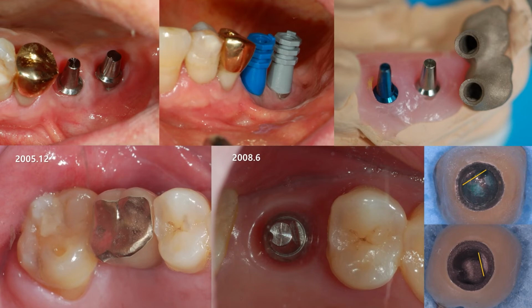Next is a case using a solid abutment. It's a very good method, but this kind of problem can occur. Screw loosening occurred within 3 years after delivering the solid abutment. This is a prosthesis form which is tightened by 35 Newton centimeter, and screw loosening occurs very rarely, but once it does, we cannot tighten the abutment in the same position. Therefore, whenever there's abutment loosening, we need to provide a new prosthesis.